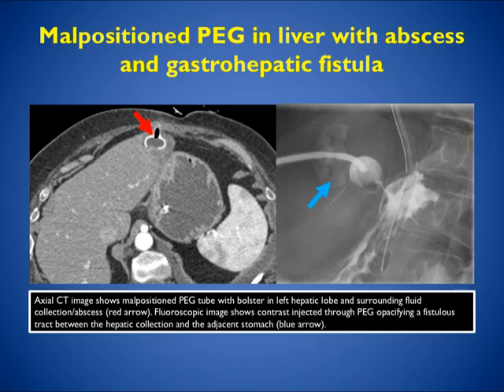In this case, look — the PEG tube is in the left lobe of the liver with fluid around it. This is an abscess with a gastro-hepatic fistula. This is indeed problematic, and you can see on fluoroscopy where the contrast is going into the liver.